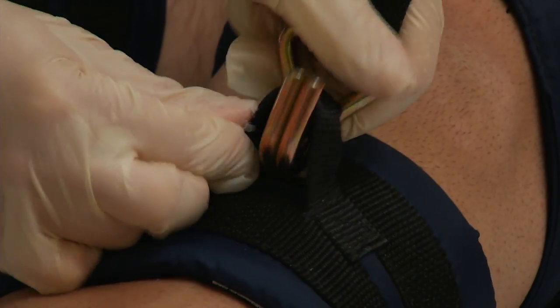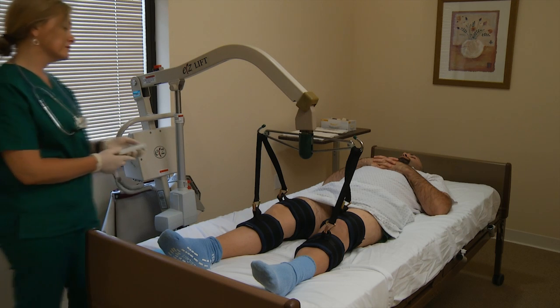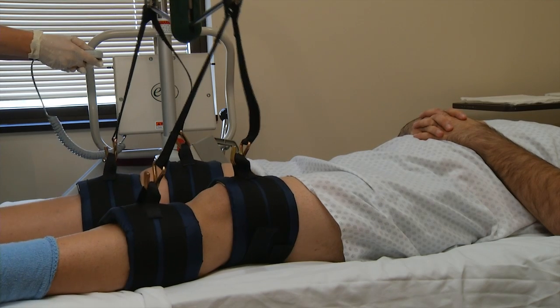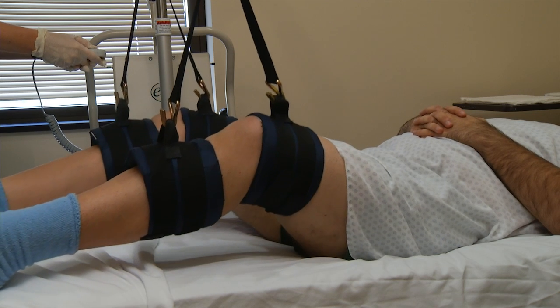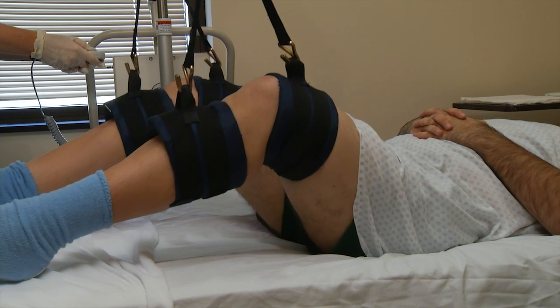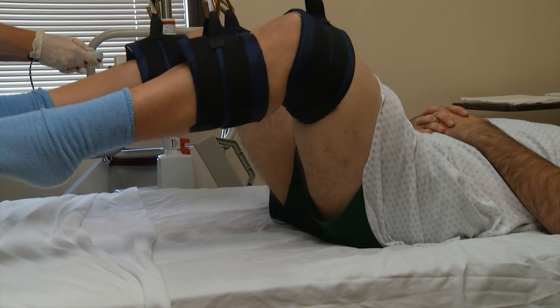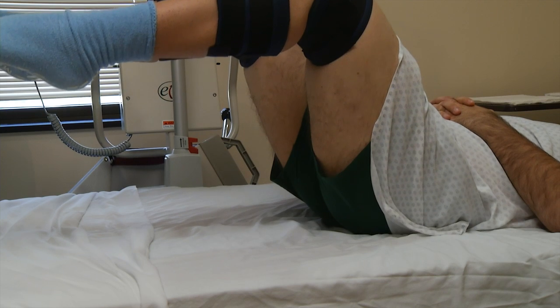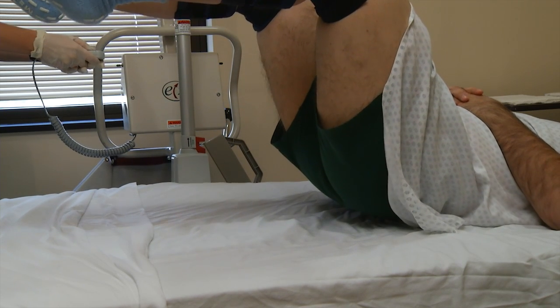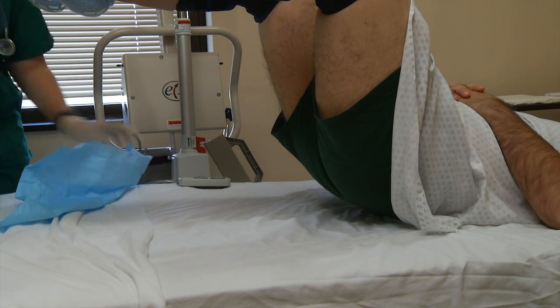Once the straps have been attached to the patient lift, the caregiver simply pushes the button, which allows the patient lifter to gently lift the patient sufficiently high for the changing and cleaning of the patient. The double strap process also allows the caregiver to lift the patient's lower body higher than the basic process allows. As with the basic process, the caregiver throughout the process has done virtually no lifting.